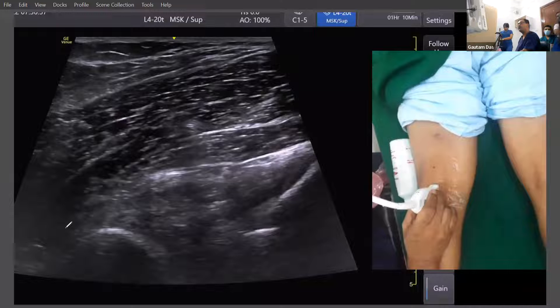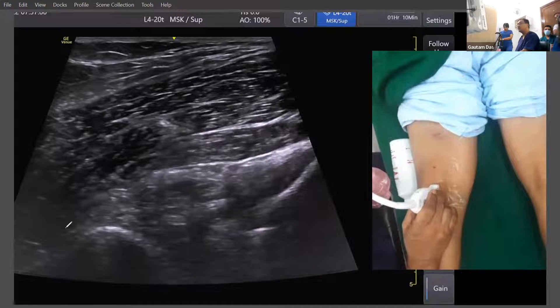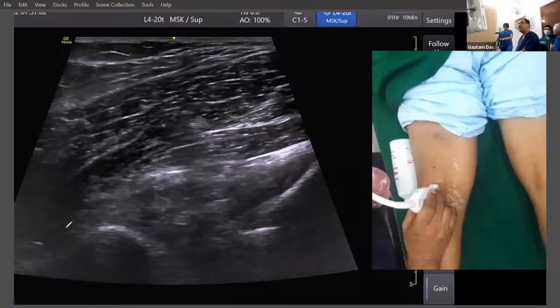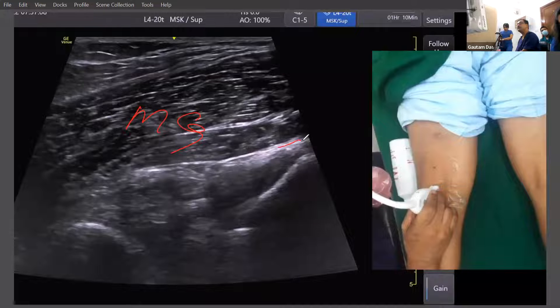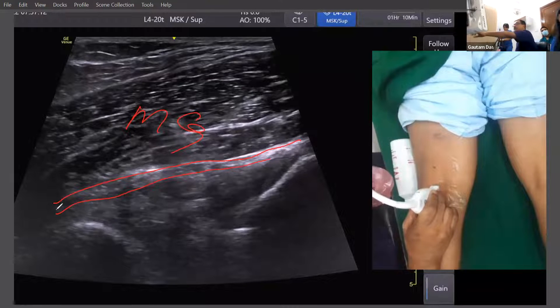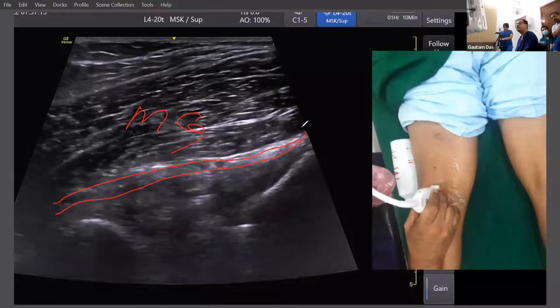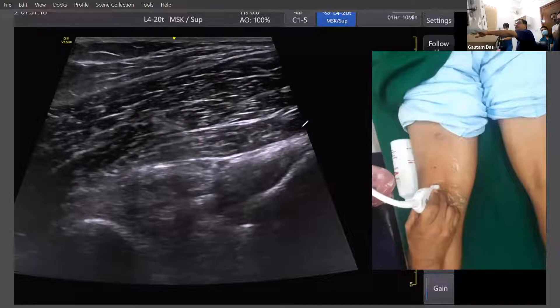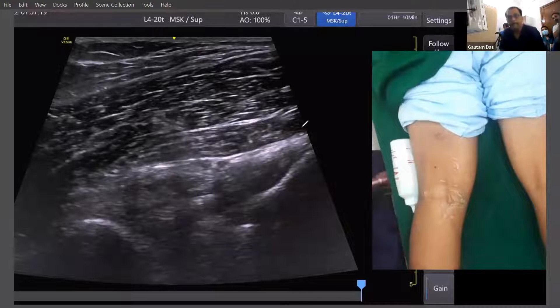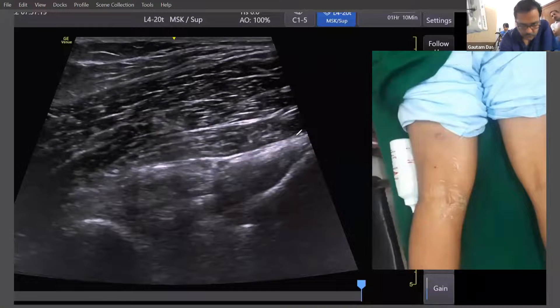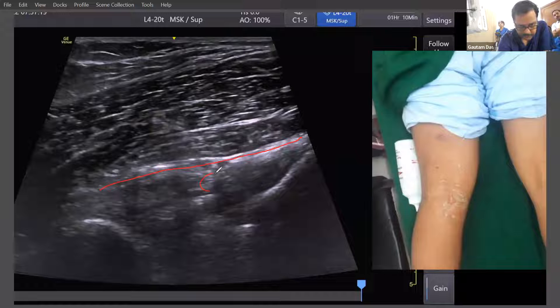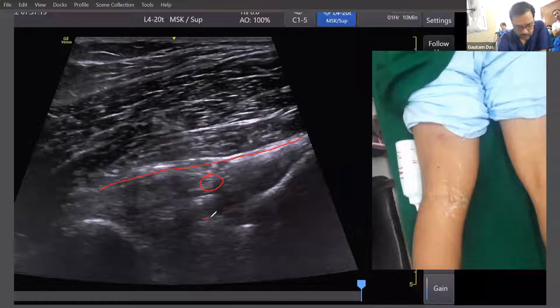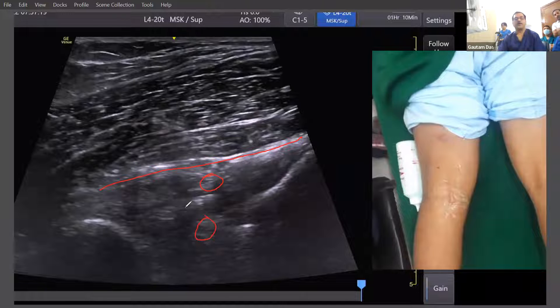On the top you can see a hyperechoic area. First is the gastrocnemius — medial gastrocnemius — and then the horizontal hyperechoic area is the oblique popliteal ligament. A very bright hyperechoic area is the oblique popliteal ligament.